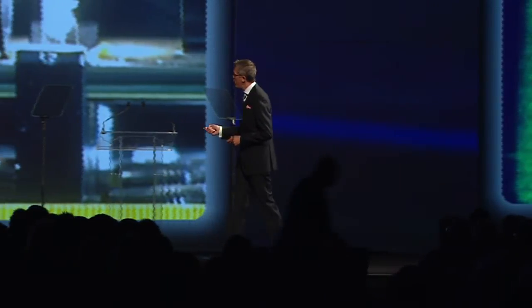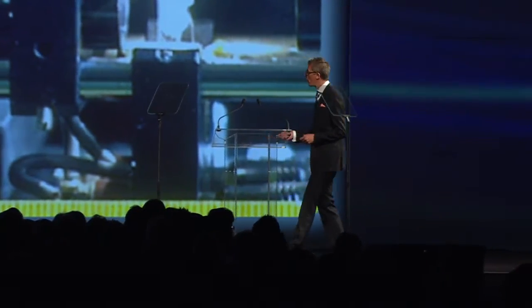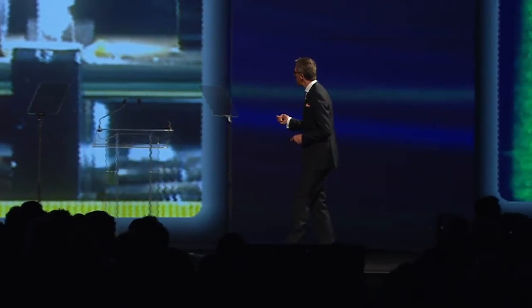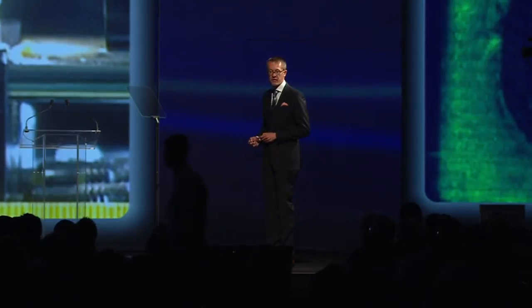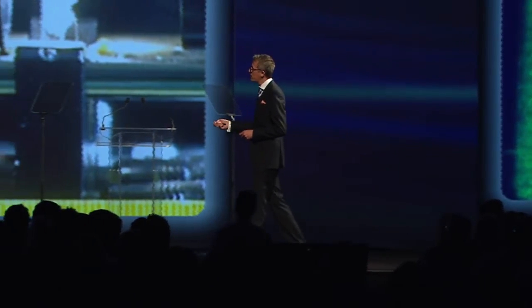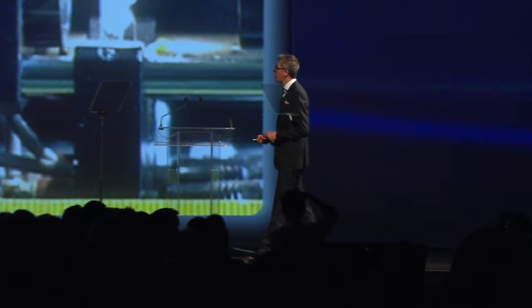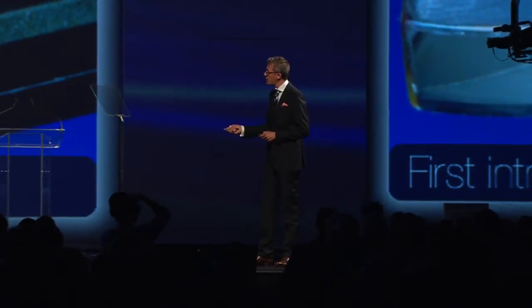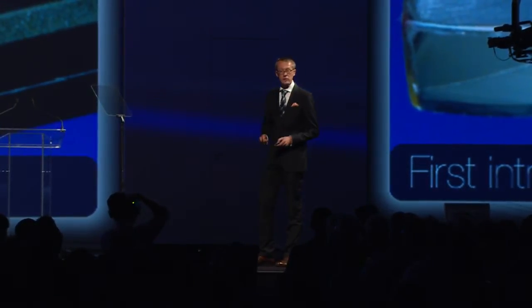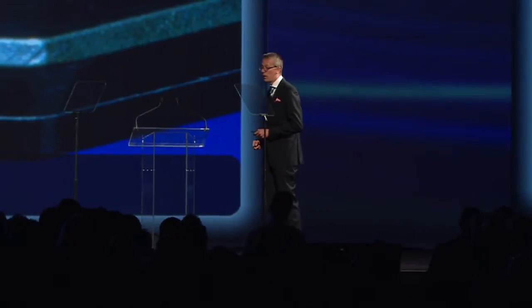So this is the very first optical setup Marco Brandestini did in the early 80s. This is a bench here. He had a light source and some lenses, and here you see the tooth with a cavity, and this was the result. This is one of the very first optical impressions done with an intraoral camera. This was the very first intraoral camera for 3D measurement. This was the CEREC prototype camera, and this was also used in the CEREC 1 system.